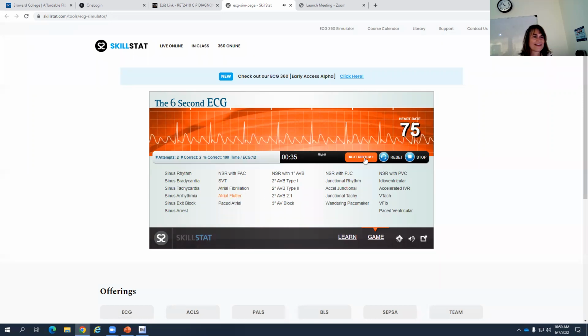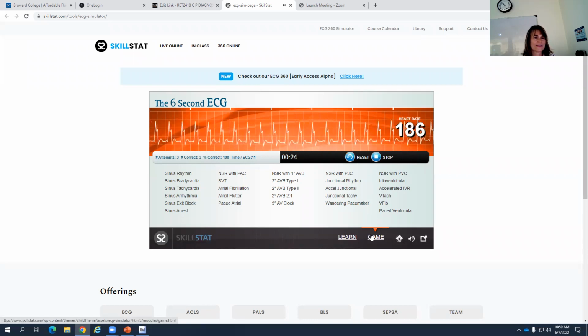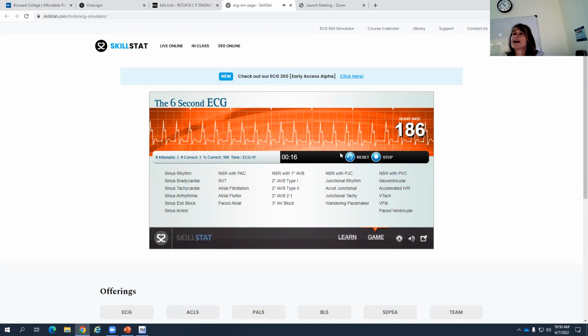Right. Looks like regular. Yeah. Okay, right. Very good. Oh, that's the block, that's the hard block. Heart block wouldn't be that fast. We, bundle branch block, that's what you're thinking of?